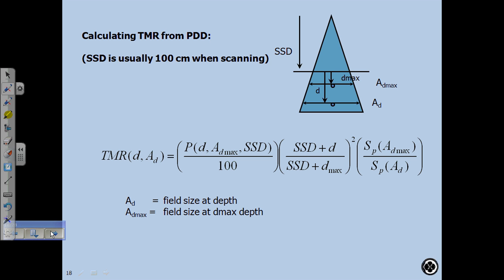Because you might have to go in there and have some kind of graduated cylinder where you pour a certain amount of water and then look at it and go out, take your measurement, and come back in. Or you could have an automated water tank.